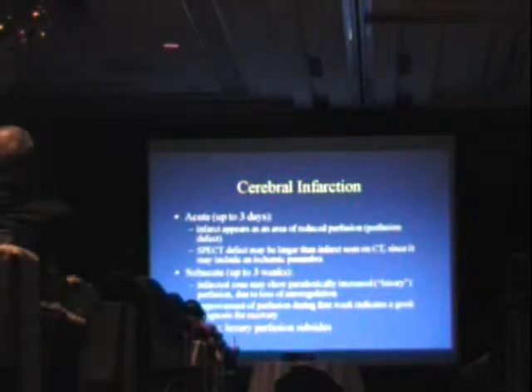Subacute infarcts, up to 3 weeks, are difficult for us to image. CT is very good in this time frame. But what we sometimes will see is what we call luxury perfusion. That's when the vessel reopens, and because you've damaged all of the vessels and all the cells around there, you are going to have a failure of the normal autoregulation in that part of the brain, so you can have a paradoxical increase in perfusion where you had a defect in the acute phase. This can last for several weeks, and during that time period, our sensitivity is decreased. You don't see this in every case, but it can be a limiting problem.